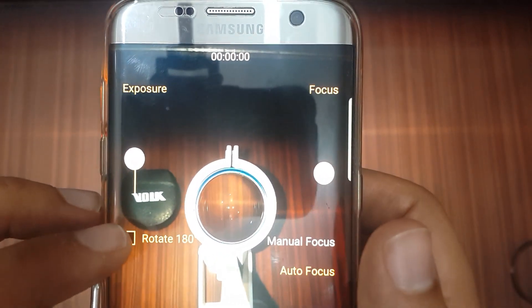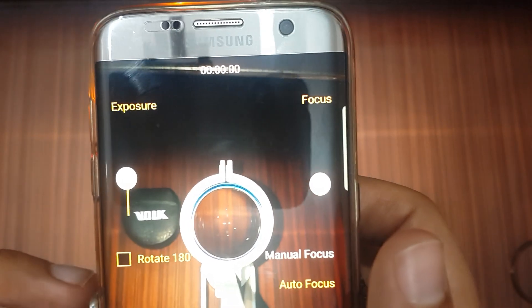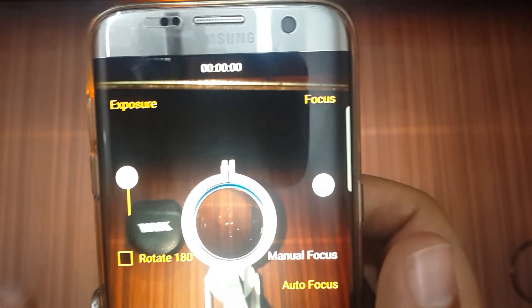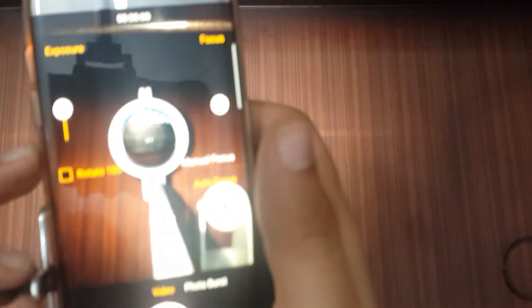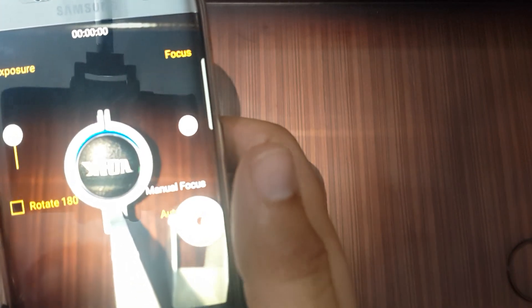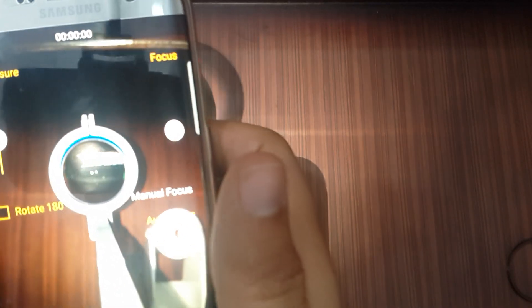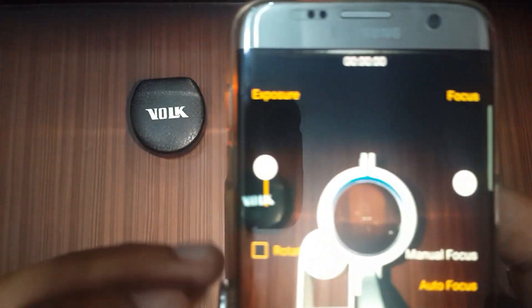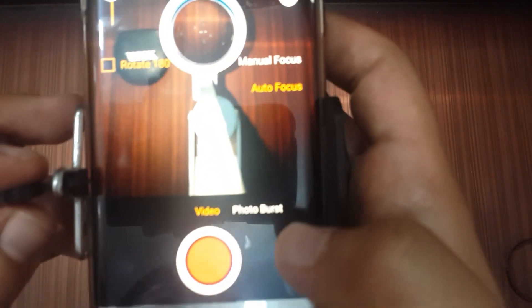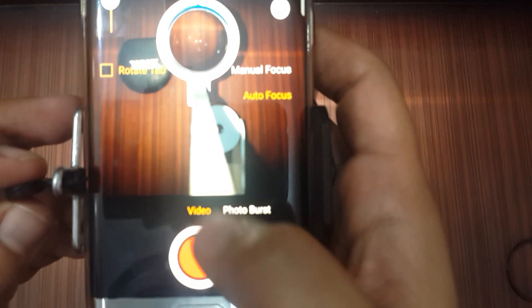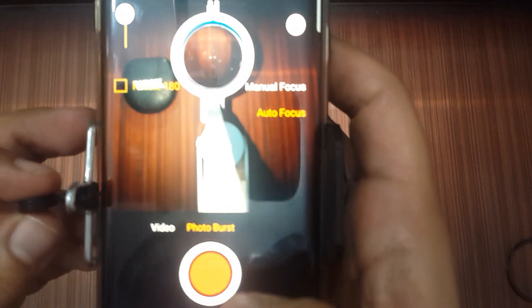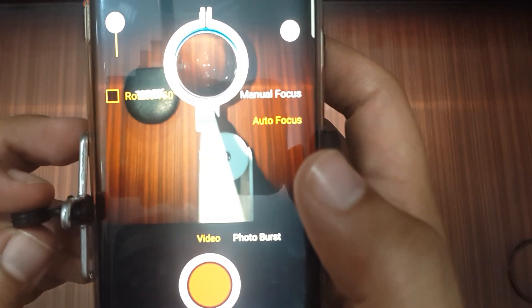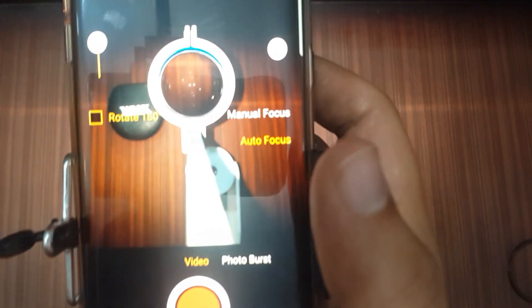Rotation 180 degrees gives you a real-time image instead of the normally reversed fundus photo. I will demonstrate in video mode and photo burst mode. These two modes can be switched by swiping between both.